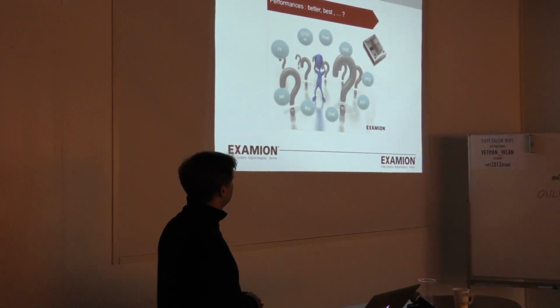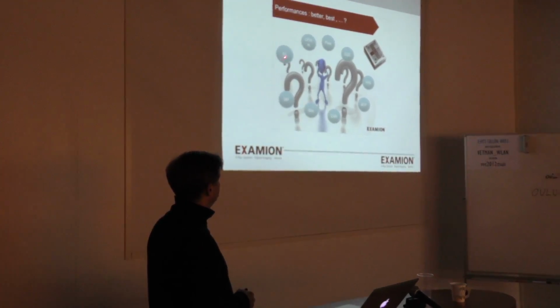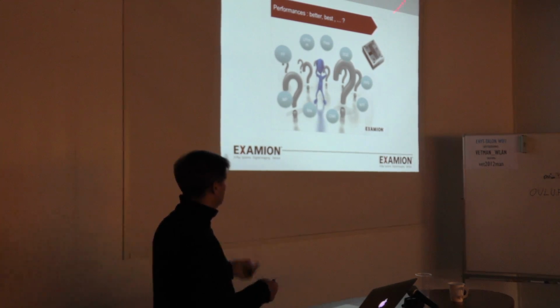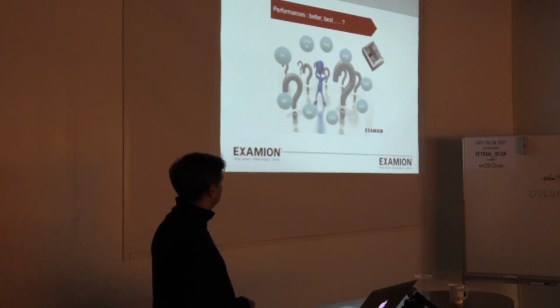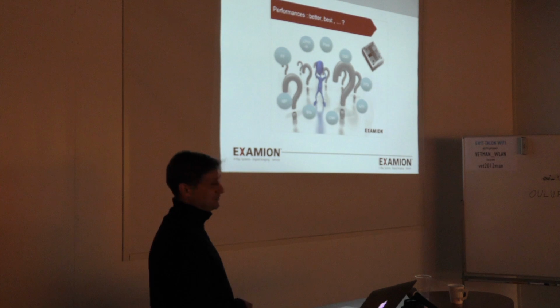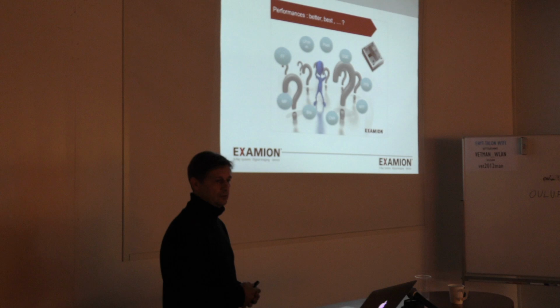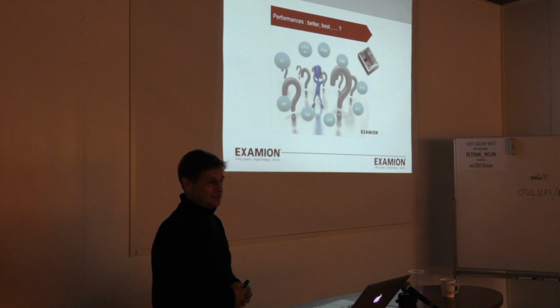And here you see some of the factors which we're looking at for image quality, just a few of them. Line pairs per millimeter, pixel size, detector quantum efficiency, FPS (frames per second), modulation transfer function, contrast-to-noise ratio, bits, and megapixels. In some countries it's very strange, like if you go into Turkey or Spain, everybody needs to know how many megapixels your panel has. Also, as much as you like, it depends how large the panel is, like your television.